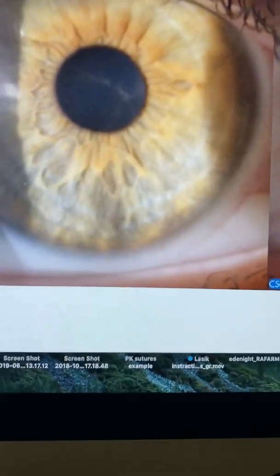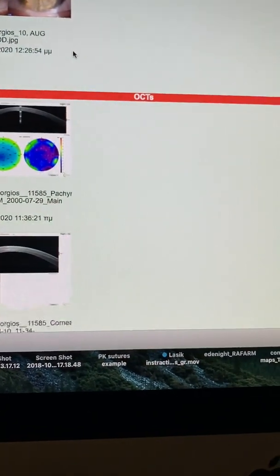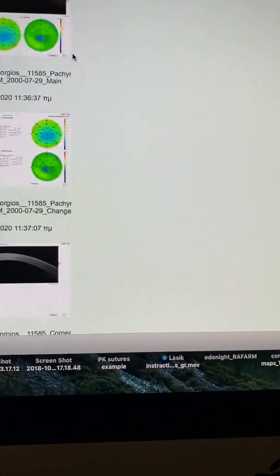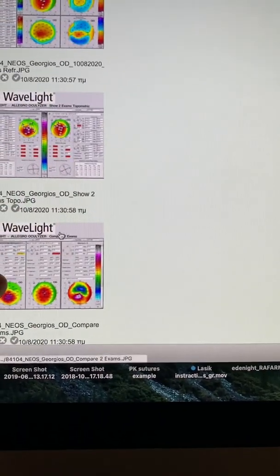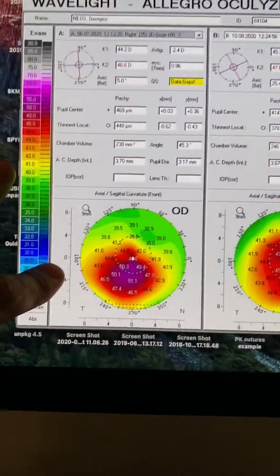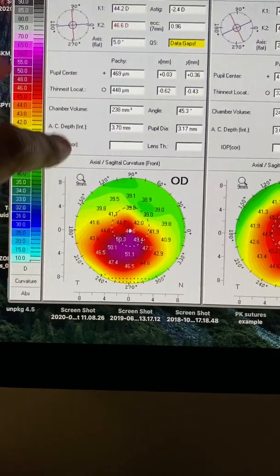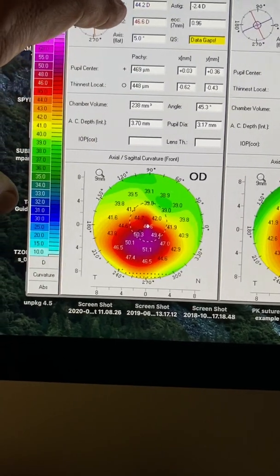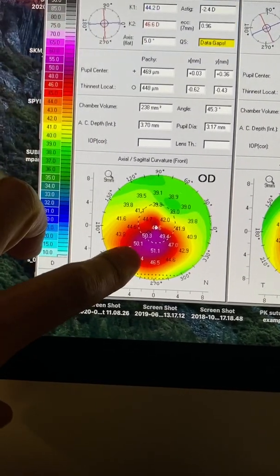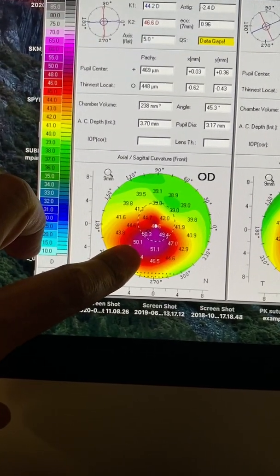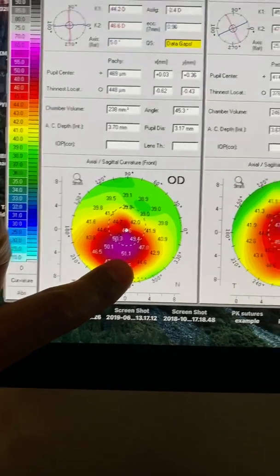Let's go and look at the one-month data as far as the Pentacam comparisons. And we're gonna go see the absolute numbers here and look at the keratometries: 42, 46.6, max K 51.1.